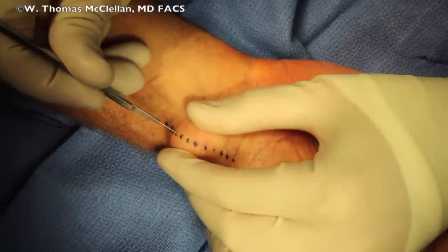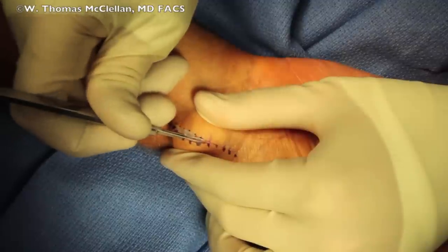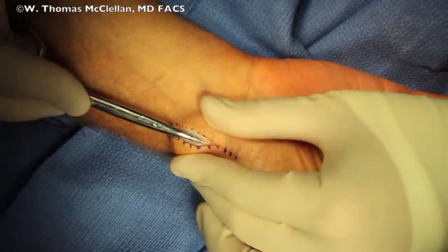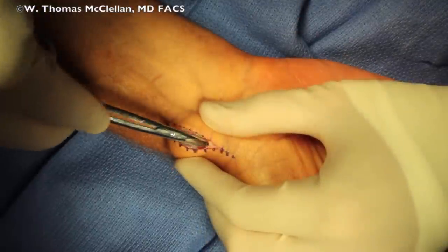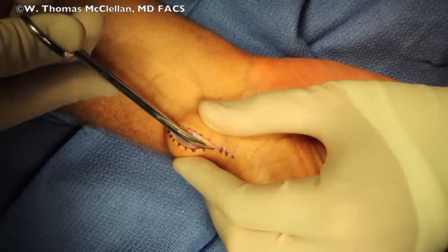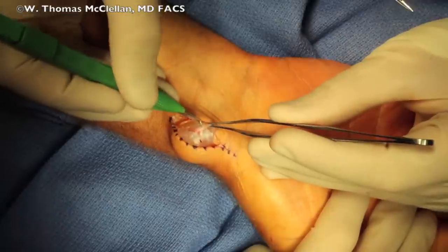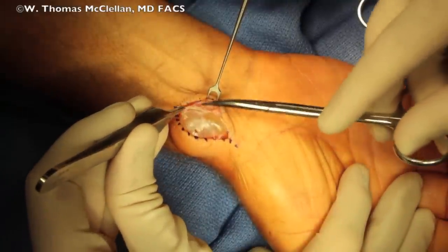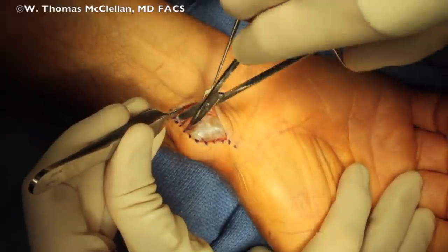I make the incision down onto the cyst, taking great care to not puncture the cyst until I've dissected around it. I use the scissors spreading over the cyst. Small vessels are electrocauterized with a bipolar, and then my first maneuver is to dissect proximally to locate the radial artery proximally and distally.